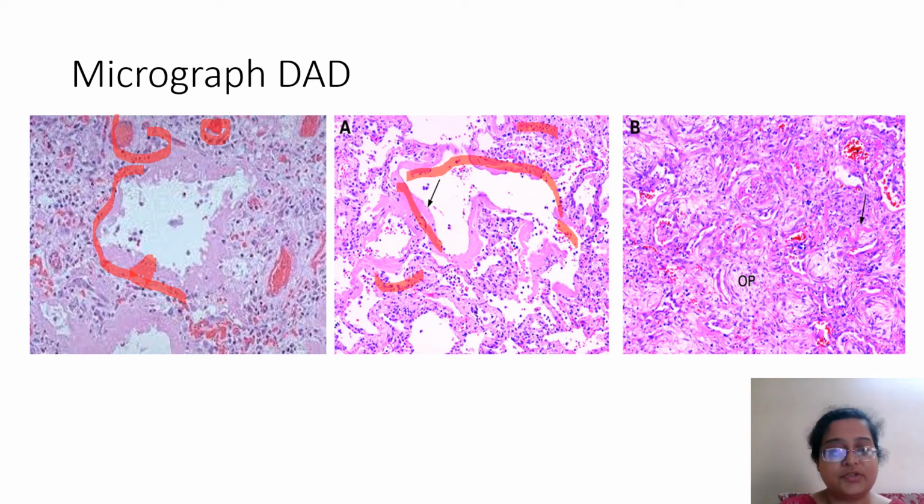If you compare this image with this image, there's more secretion and more interstitial thickening as compared to this image. So maybe this is a later form of this. And then this is the final stage where you get a lot of collagen, inflammation, vessels, so now this is a later stage of something which had set in earlier. Okay.